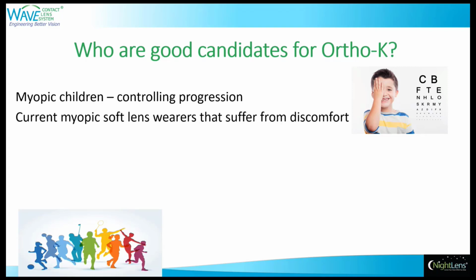Now, other patients that are in your practice that your staff and you can actually notify are our current soft lens wearers that seem to suffer from discomfort as the day goes on. These are excellent Ortho K patients, and I'm sure you have quite a few in your office.